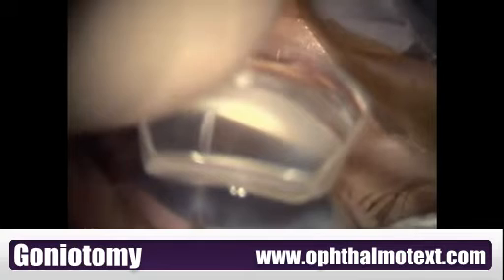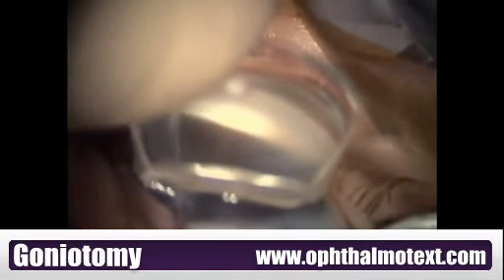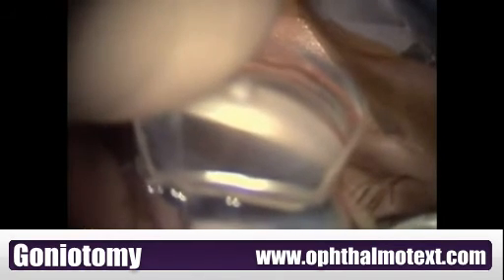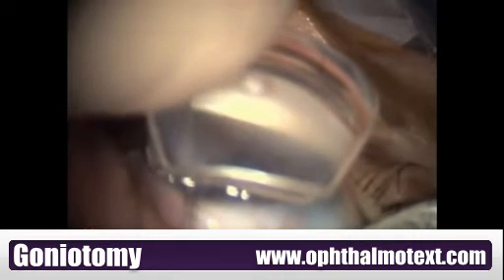the knife you can actually see a white line, which is the incision right here. As the incision is completed, the assistant can rotate the eye clockwise to maximize the length of the incision. The knife can then be withdrawn over the iris. This is to minimize accidental trauma to the native lens.